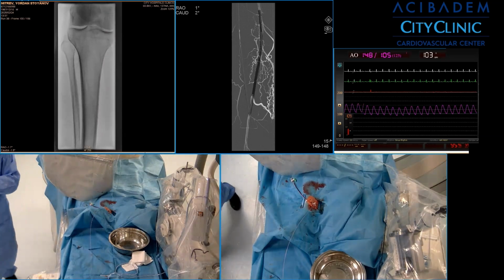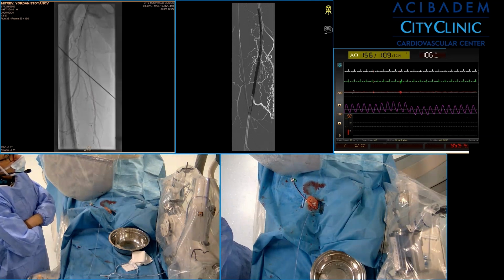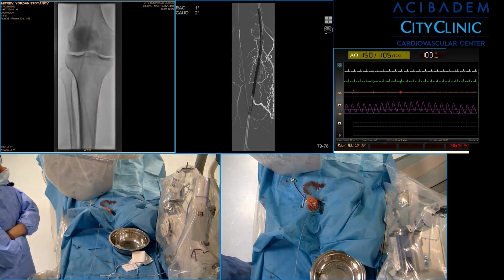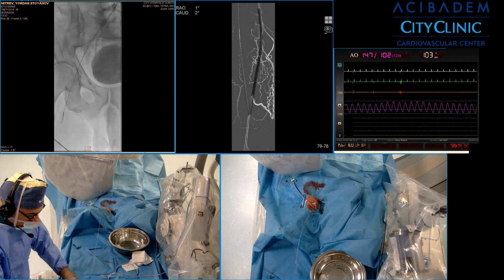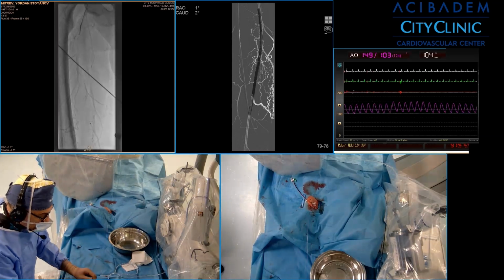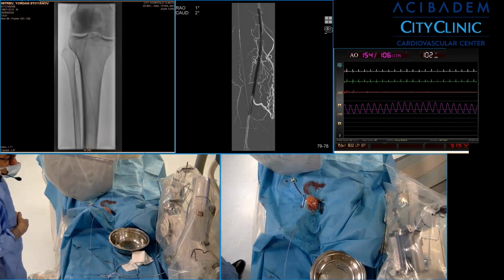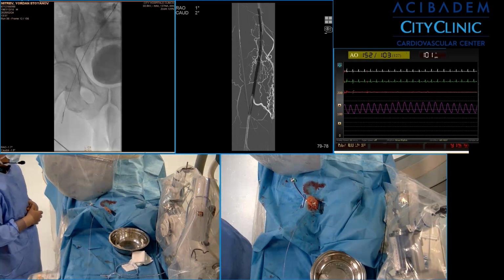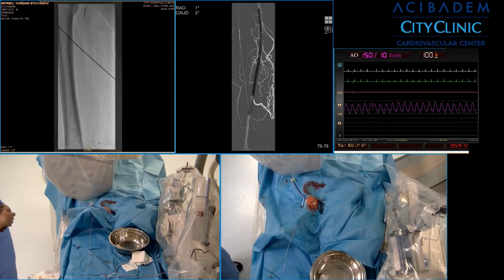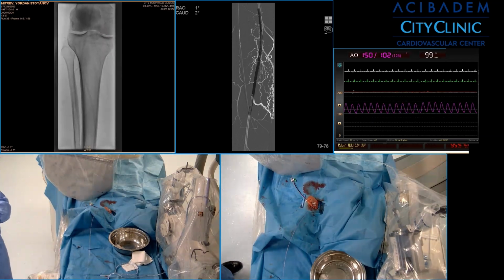The patient is doing very well. He is an excellent guy, very supportive. This is a 5 by 200? Yes, 200. This is a 5 by 200 balloon. With the exact one-to-one ratio, or pre-dilating sometimes? In this situation, it's one-to-one.